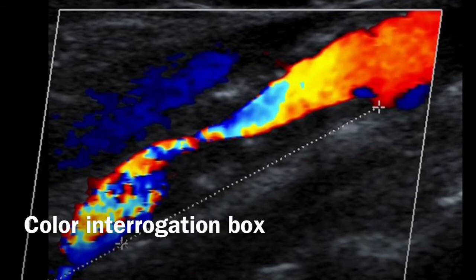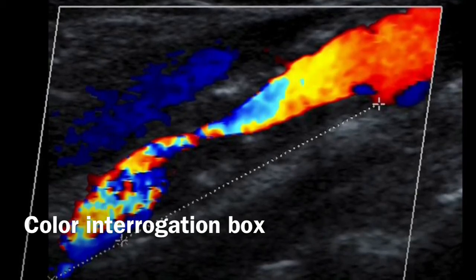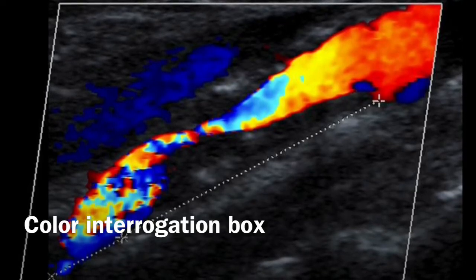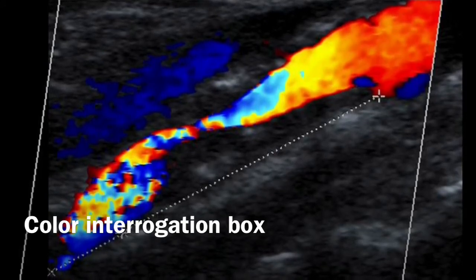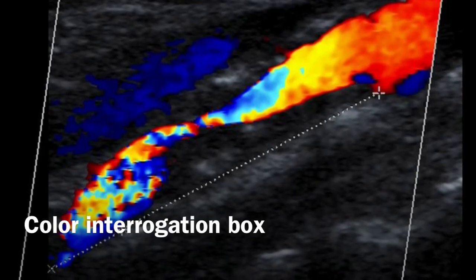The next step is to apply the color Doppler option. That uses the Doppler principle to fill up the blood vessel lumen with color. In the presence of a stenotic plaque, as we mentioned above, the small residual lumen can be outlined by this color option, thus clarifying what was seen by the B mode.